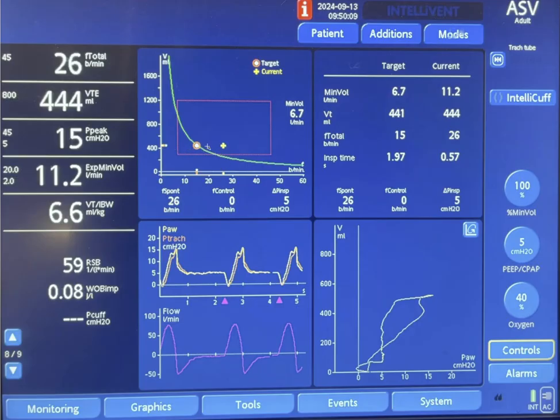So the tidal volume of 440 and you can see that here we'll come back to this is done with pressure support. You can see here that the patient is initiating all the breaths.